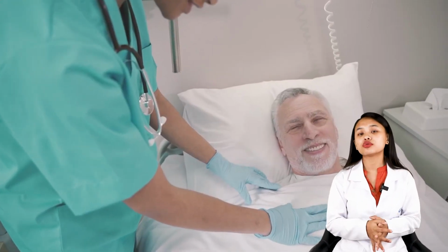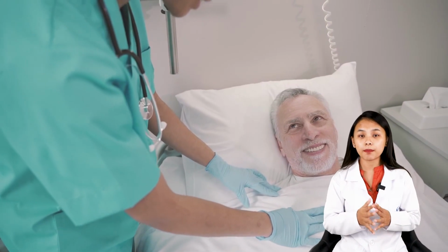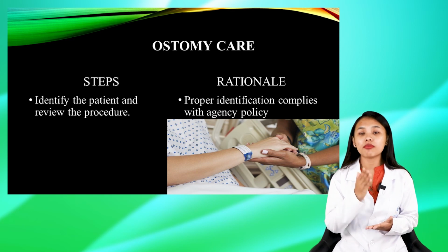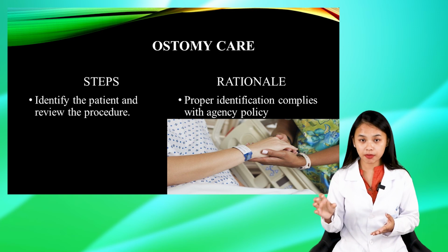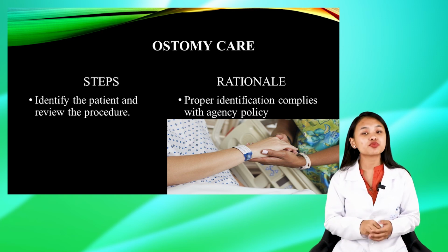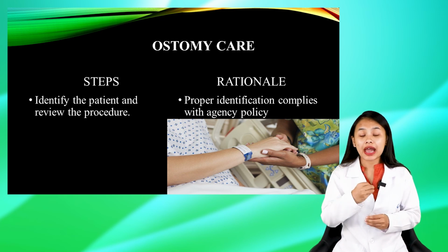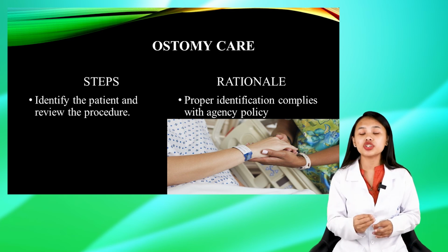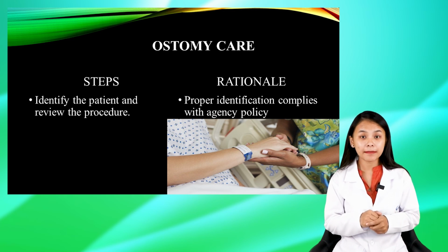It is also your responsibility to explain the procedure to the patient. Before you explain, you must make sure that you have identified the correct patient for whom this procedure has been ordered. You can educate the patient and explain the procedure to the patient as well as to the family members.